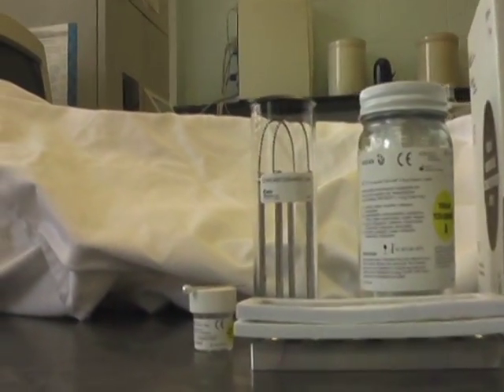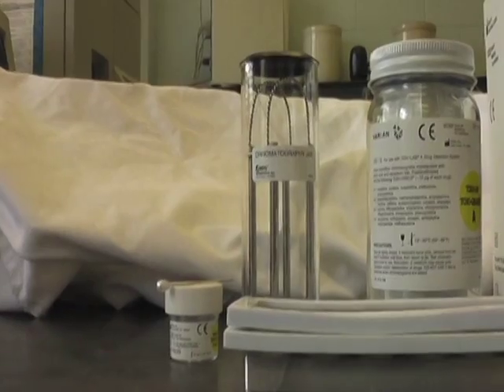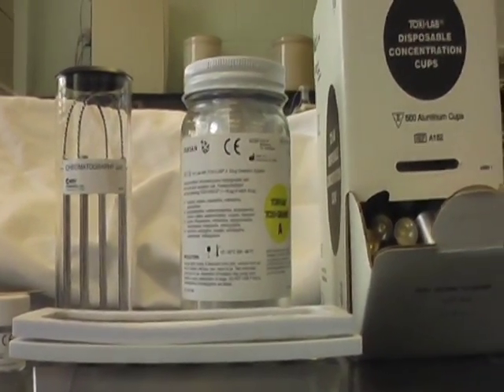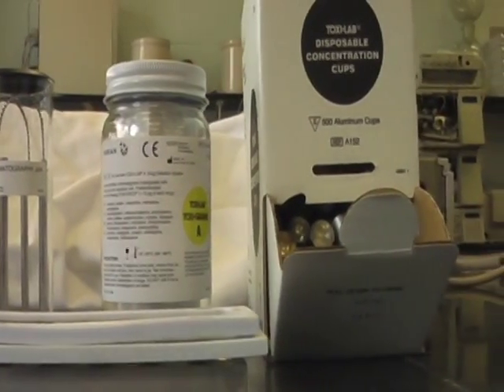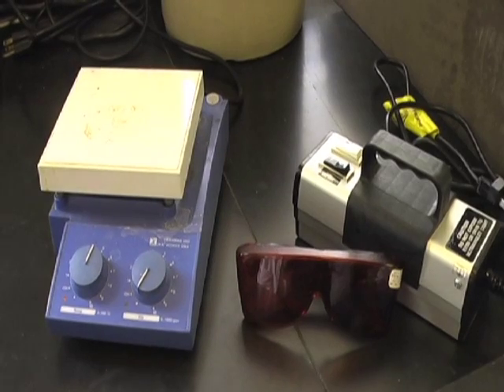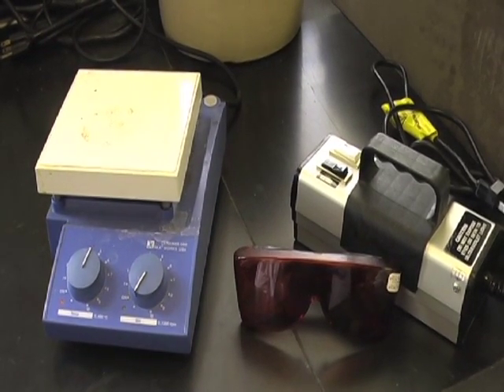This is the equipment used for a Toxilab. We have the Toxia discs, the Toxilab jar, the Toxichromatograms, the evaporating well plate, and the disposable wells. Here's more equipment used for the Toxilab: a heat plate and a UV light.